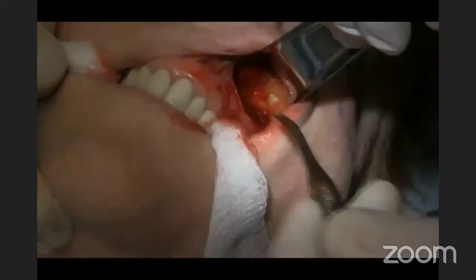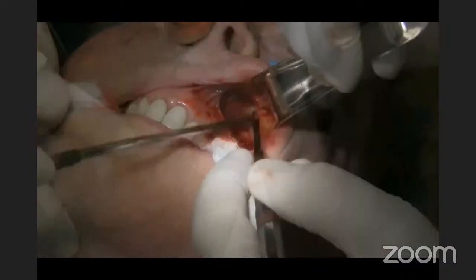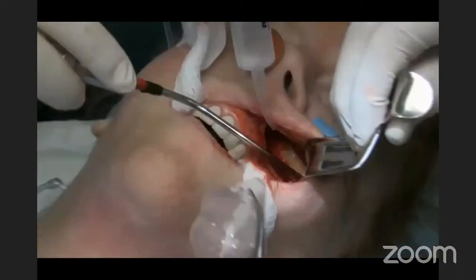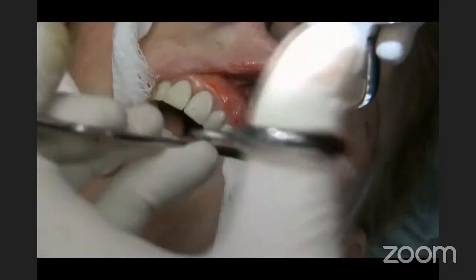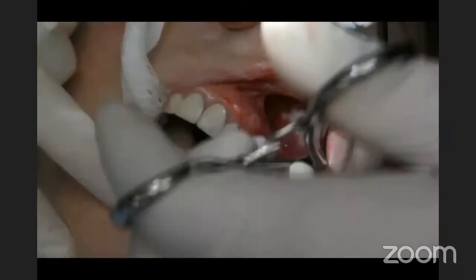Most of these implants will also sit over the masseteric tendon, which we will look at here. You can see the tendon from the masseter muscle, and that's fine for the implant to sit over that. Also, we will sometimes see the infraorbital nerve, which you obviously want to protect, and sometimes you have to relieve the implant if it's impinging on that nerve.